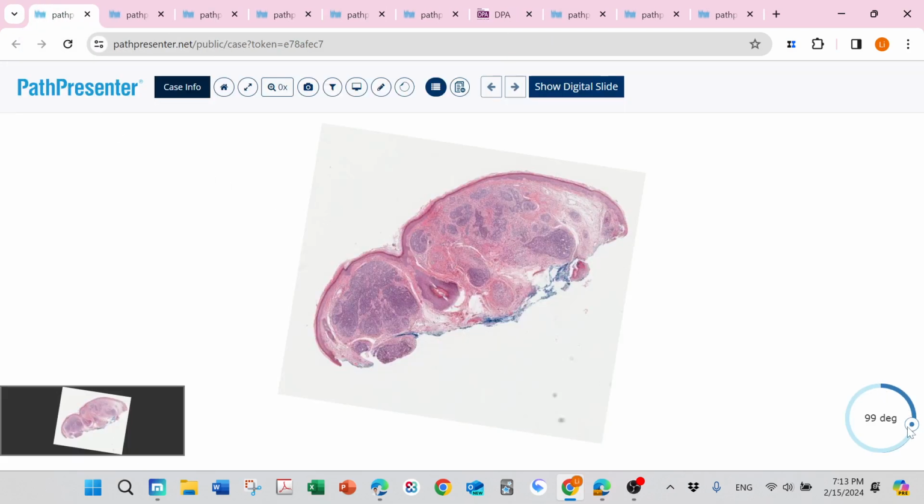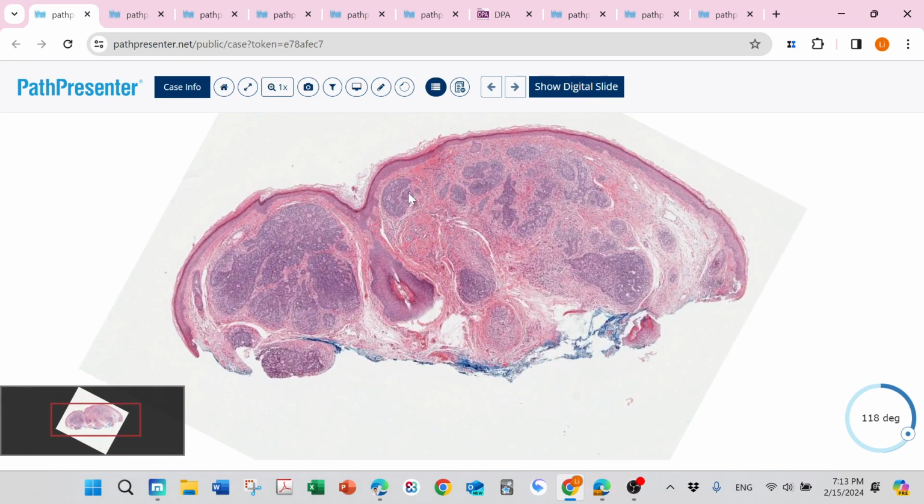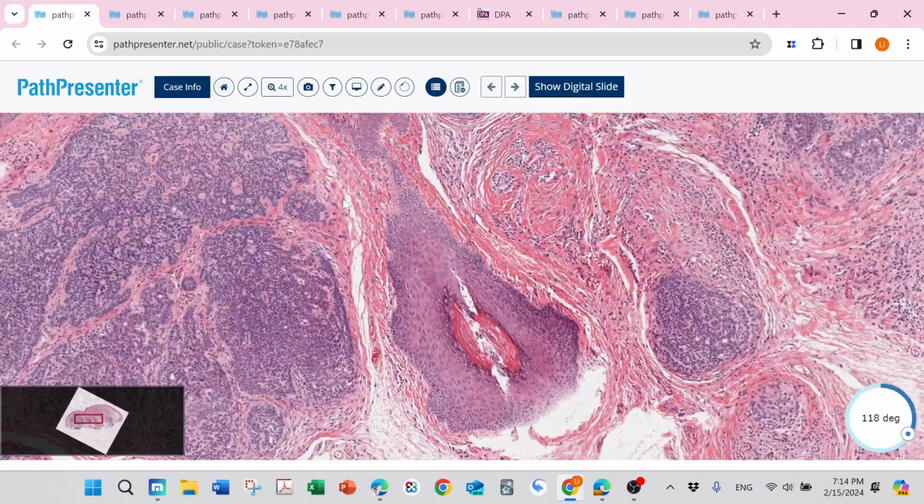This is another one, trichoepithelioma. Even in low power, even though we see this basaloid nodule, this pinkish stroma really takes you away from basal cell carcinoma. And this retraction artifact is not similar to basal cell carcinoma. This is not a true retraction artifact, because this retraction is between the stroma, not between the basaloid cell and the pinkish stroma.